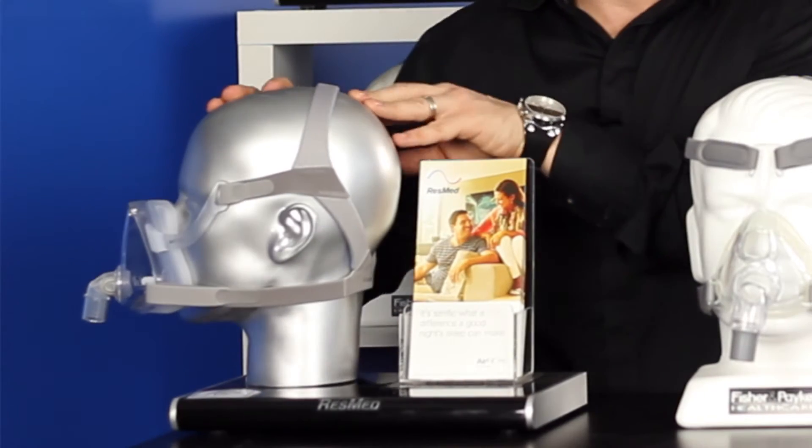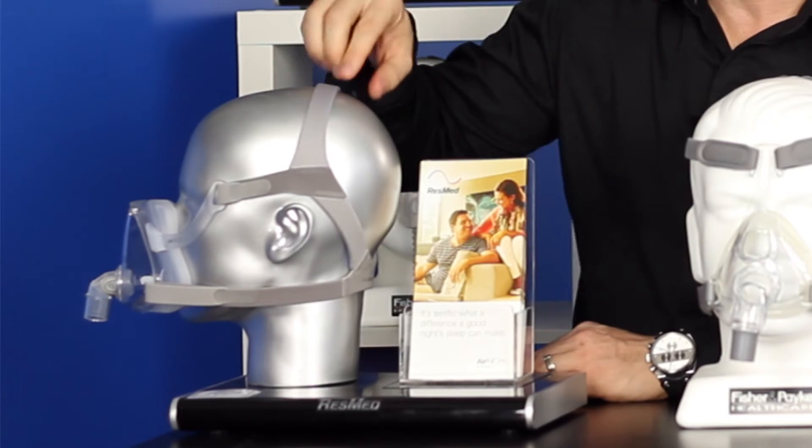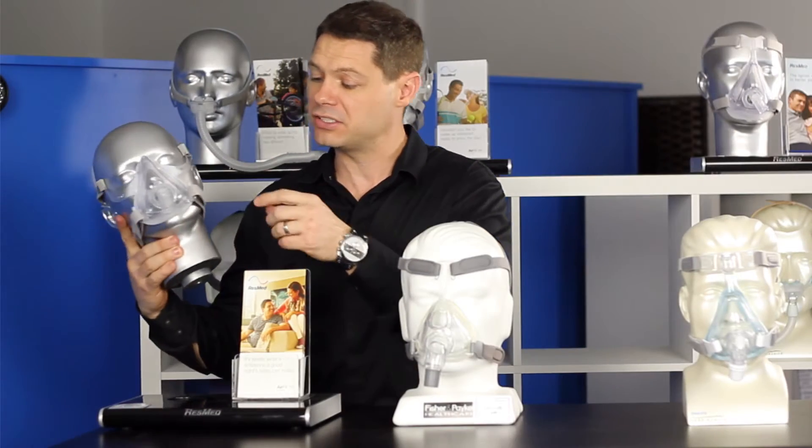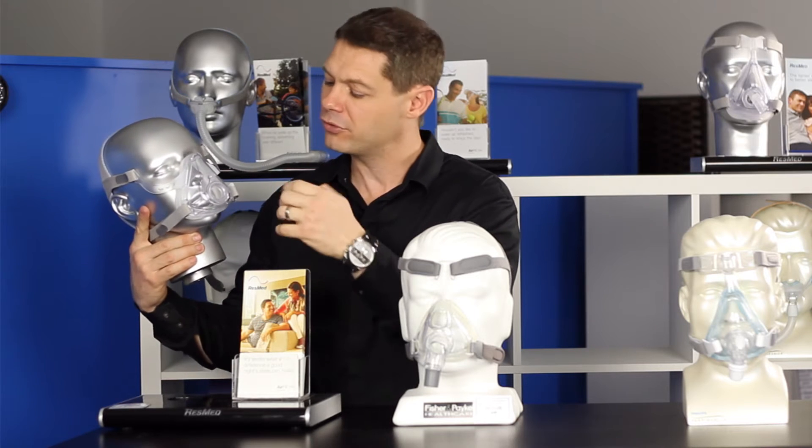And as you can see, the head straps on them is a better design — they're nice and thick. The mask itself has a removable elbow, which you pinch the little clips here to take out if you want to go to the bathroom.